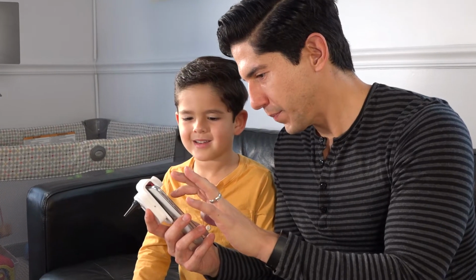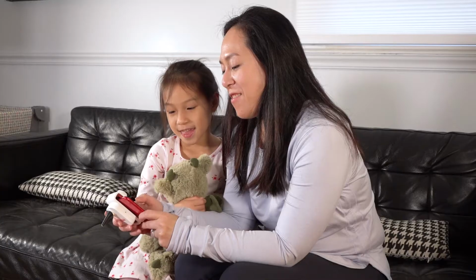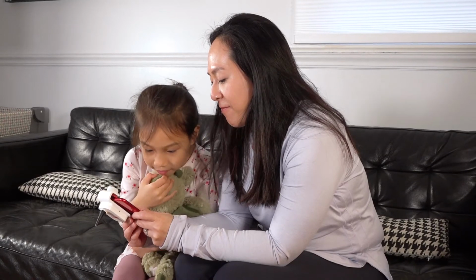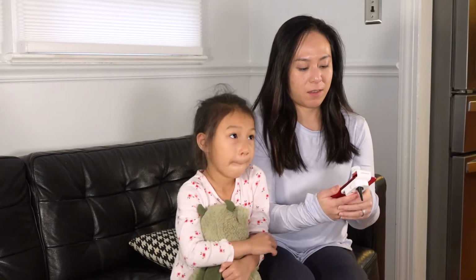Before you start, turn off notifications and put your phone in Do Not Disturb mode. This will prevent calls and texts from interrupting you when you're trying to take a recording. Have your child sit upright in a comfortable place.